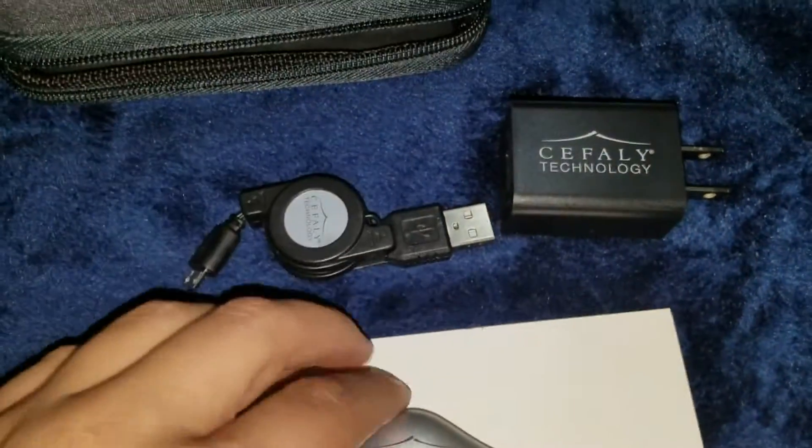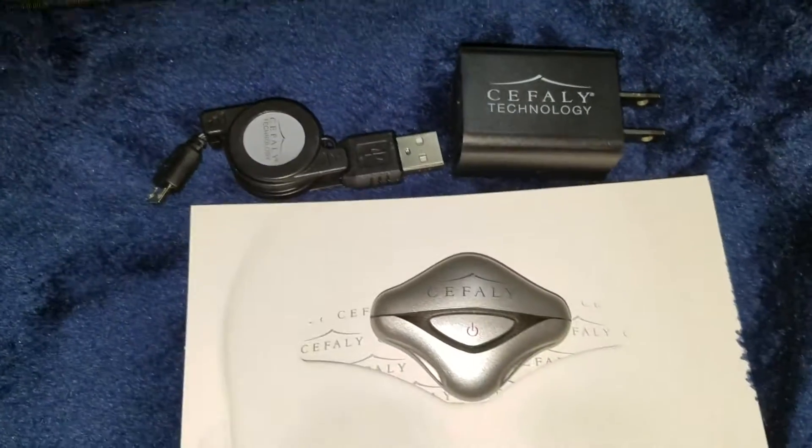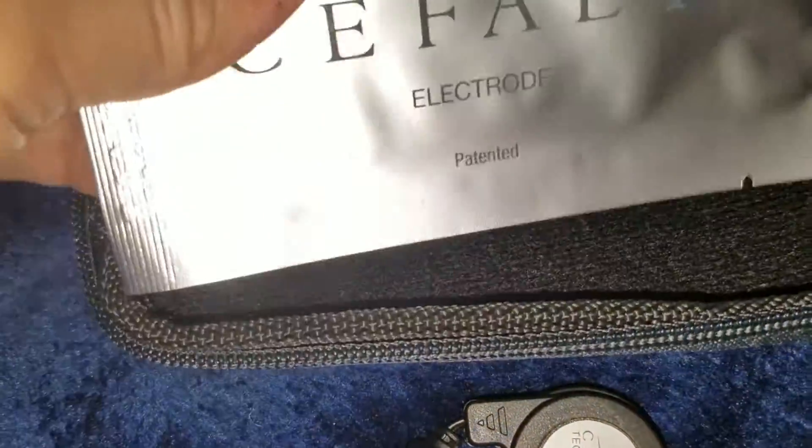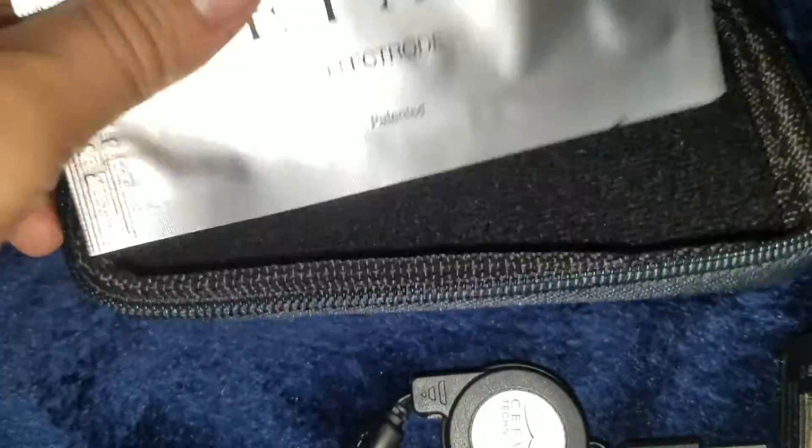It comes with one electrode. These are normally, I believe, $25 each. They do last an entire month, supposedly — we will find out.